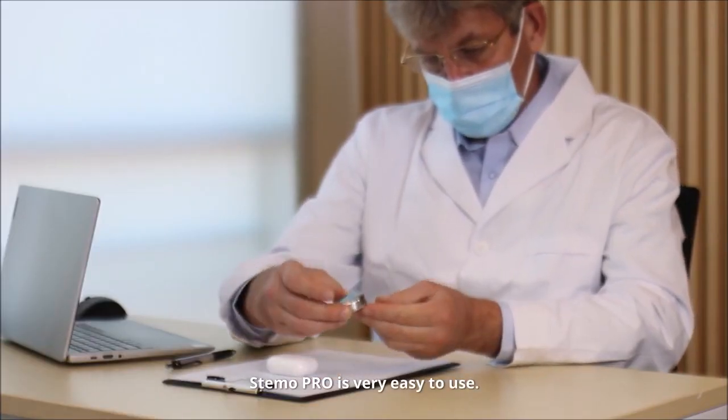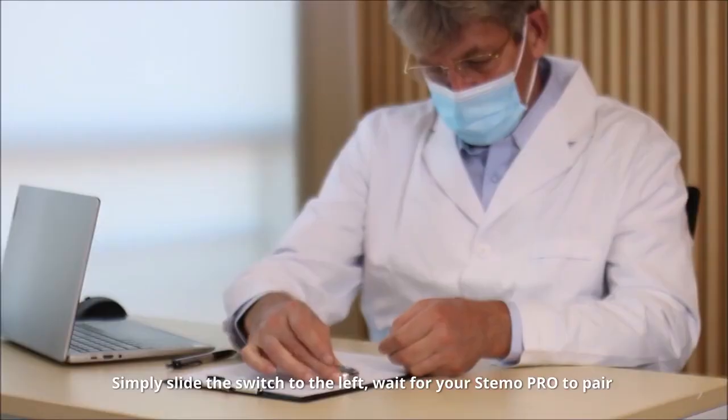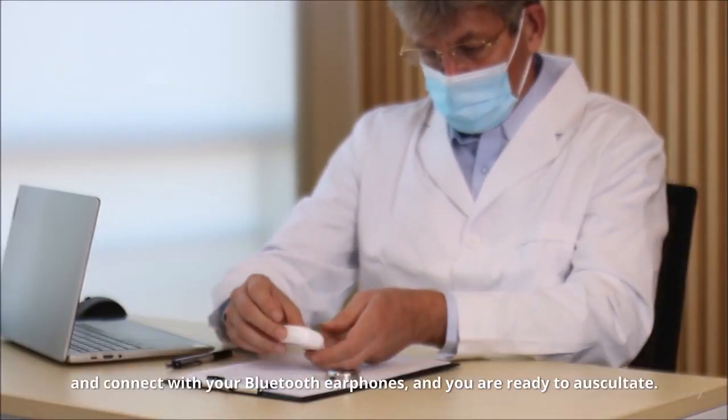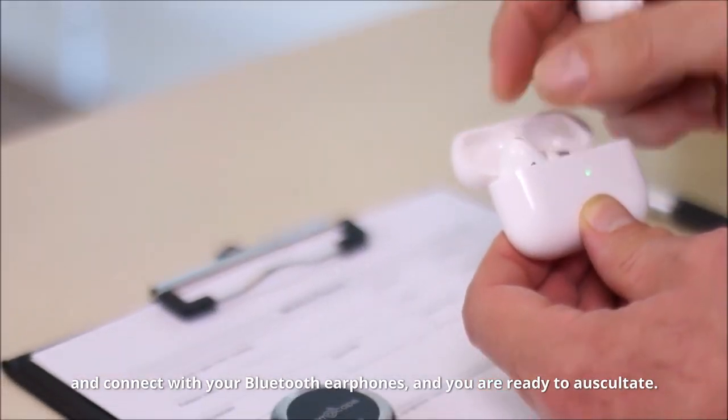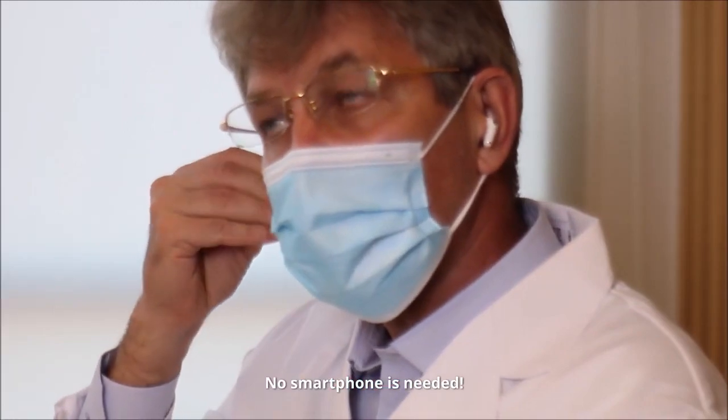Stemo Pro is very easy to use. Simply slide the switch to the left, wait for your Stemo Pro to pair, and connect with your Bluetooth earphones, and you are ready to auscultate. No smartphone is needed.